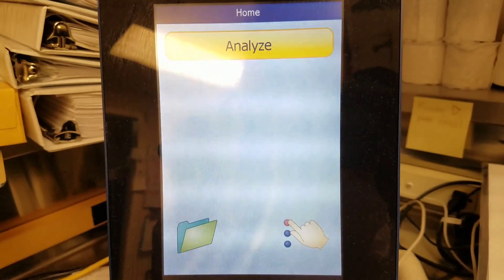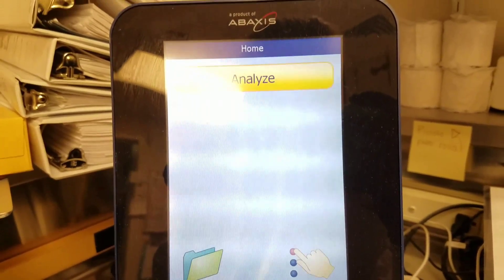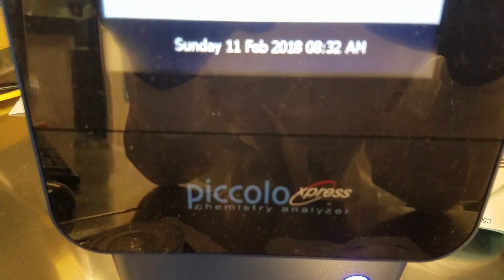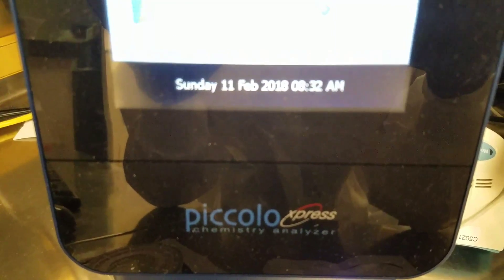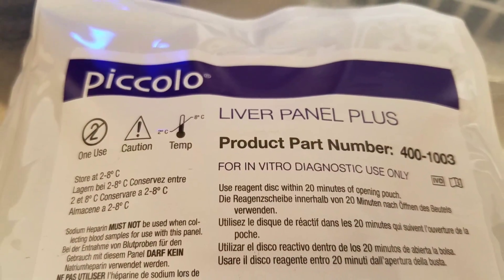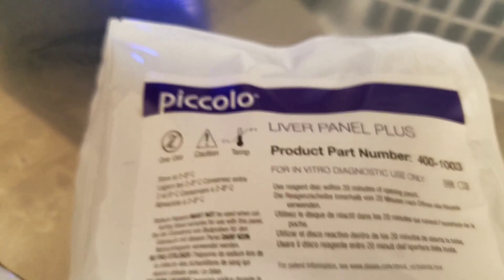Hey guys, it's Mara. In today's video, I want to show you how to run QC on the Abaxos Piccolo Express. This is a chemistry analyzer. It is kind of a tabletop, really small analyzer, and it is our backup analyzer. The only tests that we run are this Liver Panel Plus and then we also run the BMP, so just the basic metabolic panel.